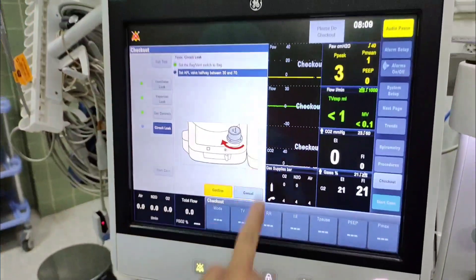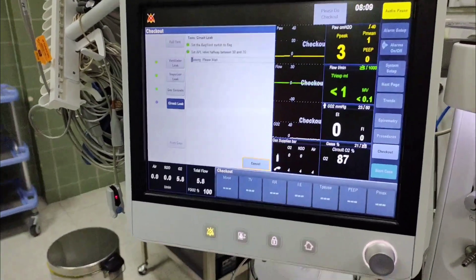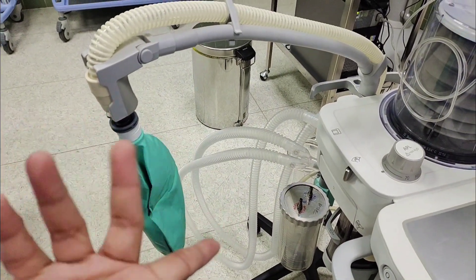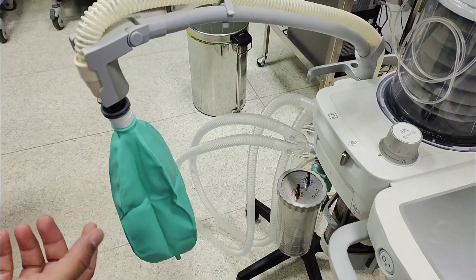It is written 30 and 70, confirm. You see, it will make the bag big and check if the bag is having any leak or not.